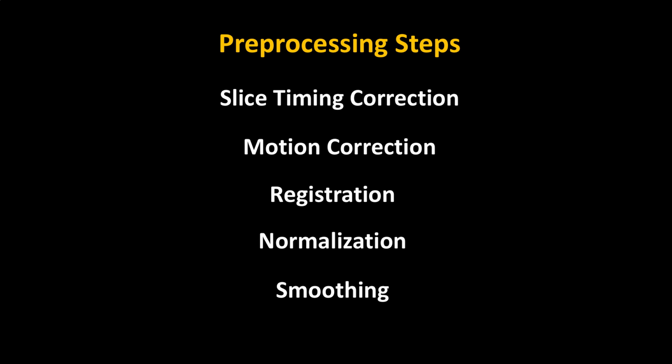And remember, the whole reason we're doing pre-processing is so that we can get a cleaner time series, something that's not confounded with anything that we don't want it to be. If you've worked with fMRI data for any length of time, you're aware that it's mostly crap, right? I mean, it's very, very messy. There's no other way to describe it. That's why we need so many trials to get a good estimate of what's going on. And then on top of that, people are breathing, they're moving, they're doing all kinds of crazy stuff, and we need to filter all that out.